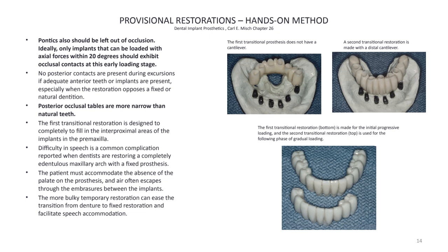But meanwhile, the patient is going to go through a process of moving from complete denture, from removable to fixed, right? Because sometimes the patients want to get rid of dentures and have a fixed bridge in their mouth instead of partial dentures or complete dentures.